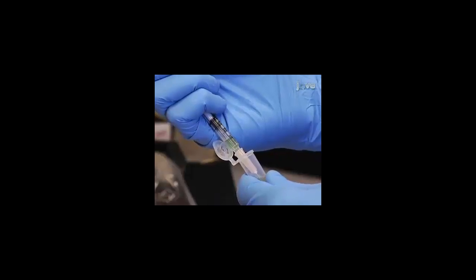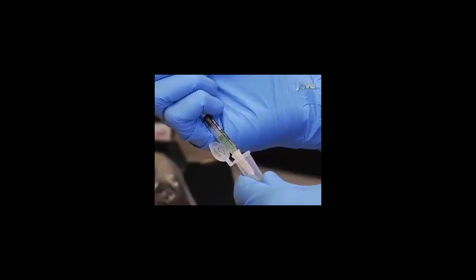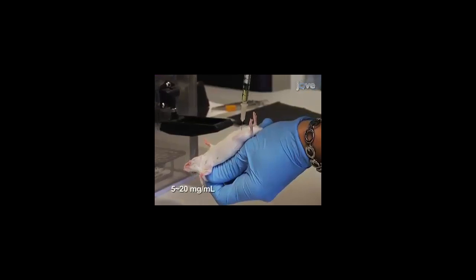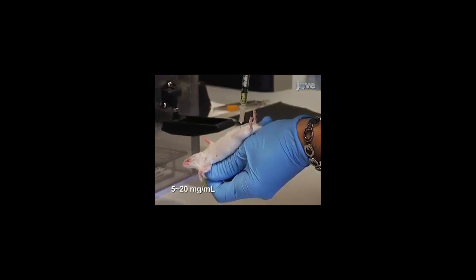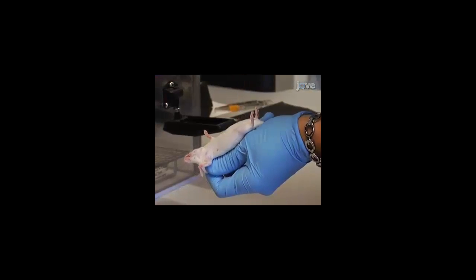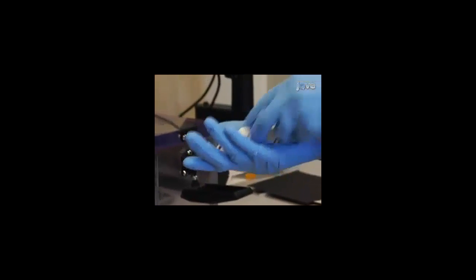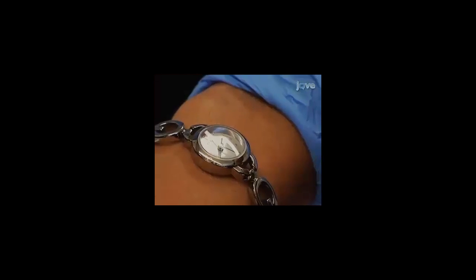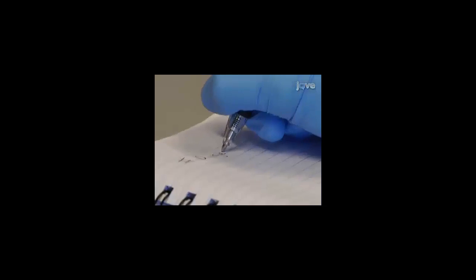Load the luciferin solution into a syringe with an attached 30-gauge needle. Verify the depth of anesthesia of an isoflurane anesthetized mouse by toe pinch. Then, deliver 200 microliters of prepared luciferin solution via IP injection. Then, place the luciferin-injected animal back into the induction chamber. Record the time of injection in order to keep the time consistent between luciferin injection and imaging performance throughout the study.